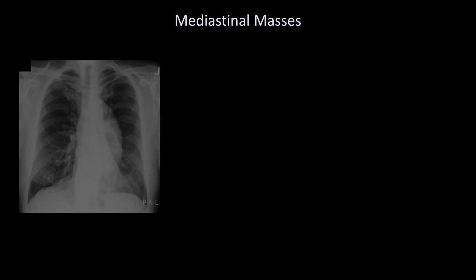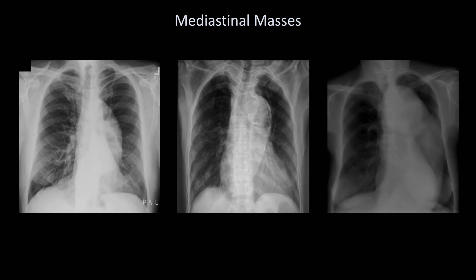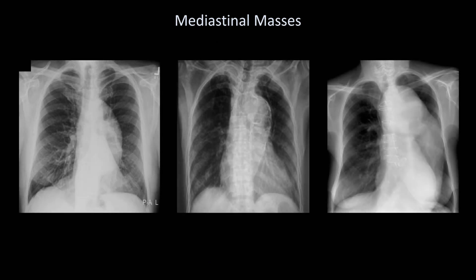Here is an interesting collection of mediastinal masses which are critical to accurately identify — these are all aortic aneurysms. The one in the middle is particularly easy to identify given the calcified walls, since only vascular structures or cysts tend to do that.